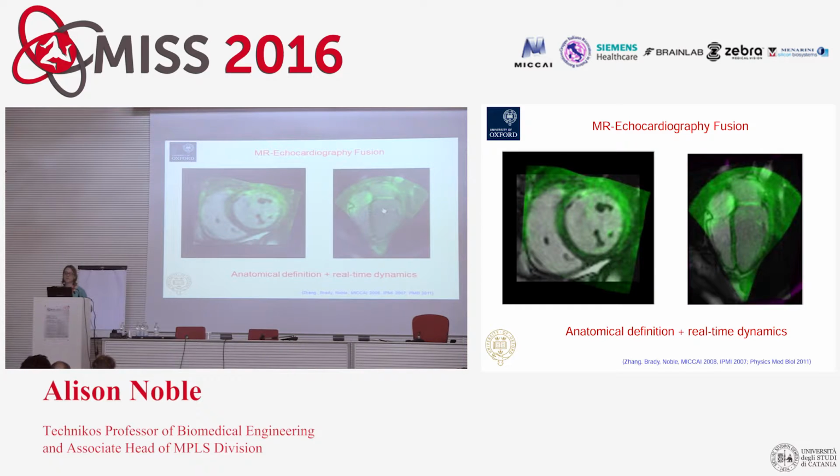Other sorts of work we've worked on, MRI and ultrasound fusion. The motivation there is to look at how, with non-rigid registration techniques, you can benefit from the nice anatomical definition provided by MRI and complement that with the real-time nature. If you look at the example over here, and you focus here, what you're seeing is that having registered the MR and the ultrasound, you can see the valve moving. The green there is the ultrasound superposition. It allows you to look at the valve dynamics together with the anatomical definition of the MR.